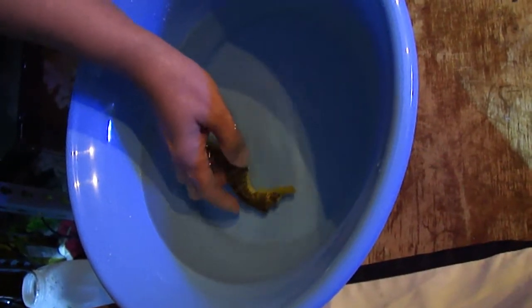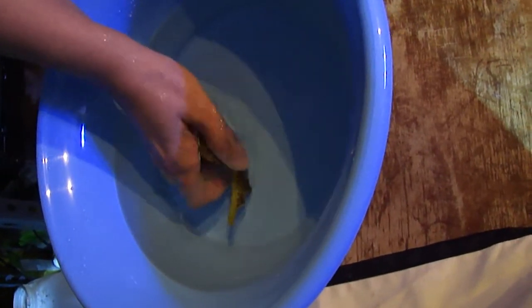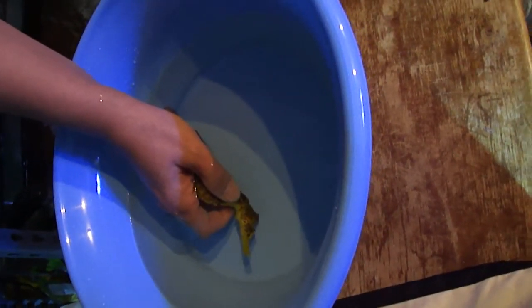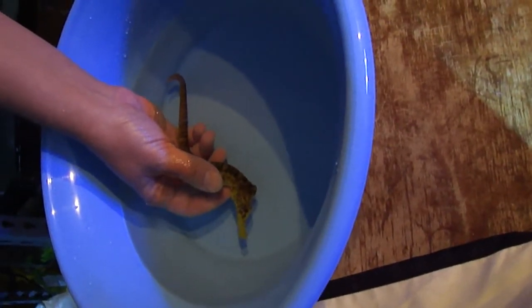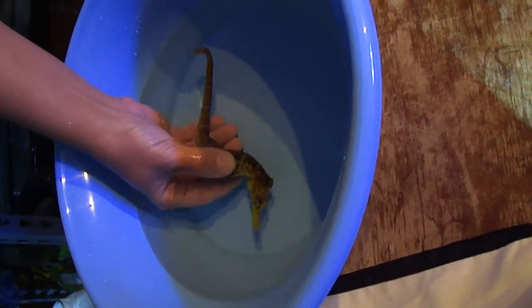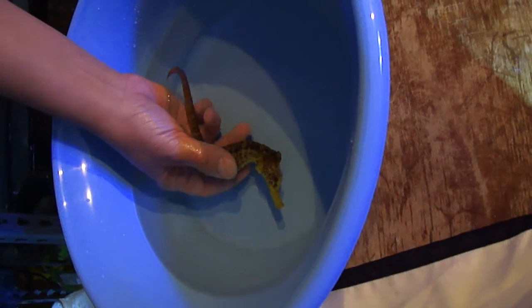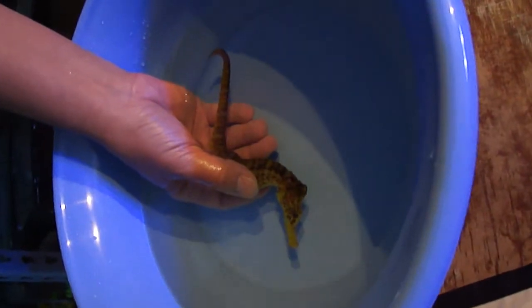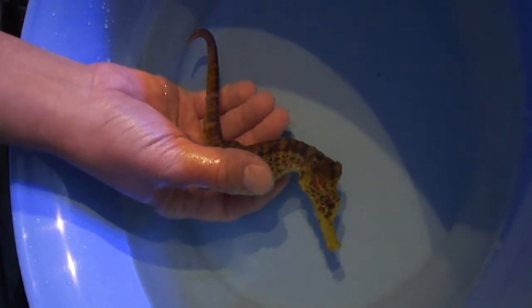She's in the clove oil and still not really sedated yet, still kind of moving around. I don't have a lot of water in the bucket so I'm trying to make sure she stays submerged in the clove oil, but you want to make sure she's breathing — which she is. The key, from what I'm told, is that they will go limp, and that's really the way to judge. Right now she's still kind of fighting me. When I push a little bit on her tail she's not really relaxed yet. I can see her breathing, which is good, because she's a strange one — when I grab hold of her she stops breathing just because I've got her. She doesn't like to be restrained obviously.